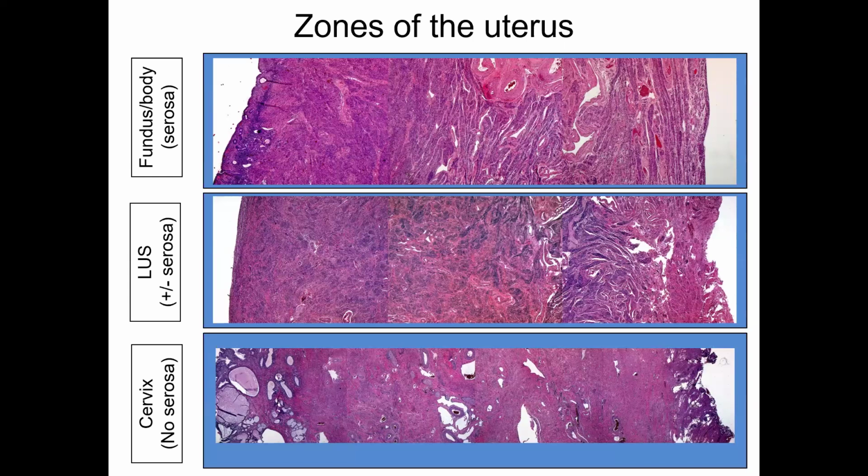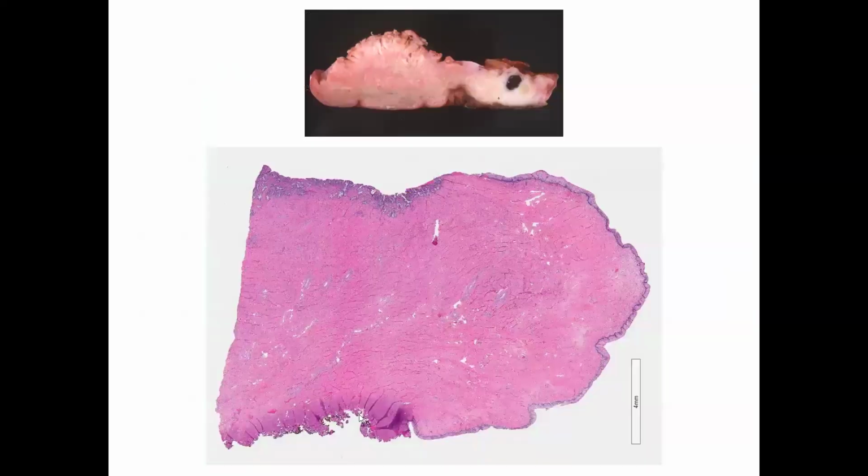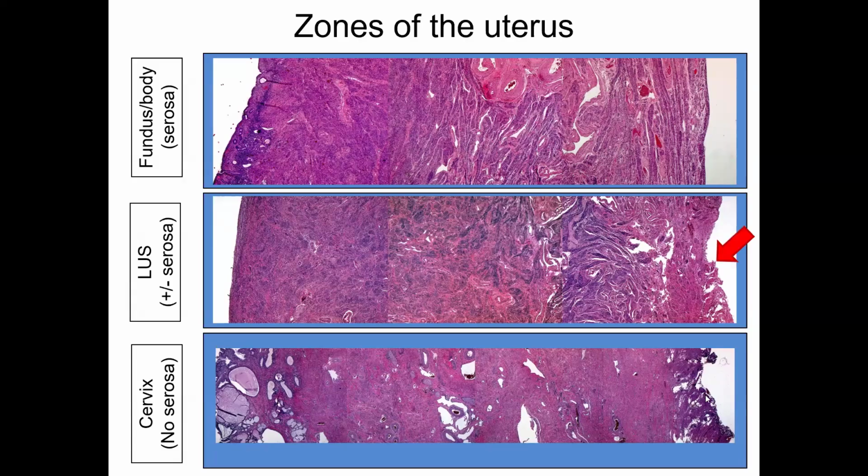This is a nice composite. I hope you think it's nice. So this is your cervical section. Here is the endocervical mucosa, and these are the endocervical glands. And here's the stroma of the cervix. Out here, what do we have? We have a cauterized tissue. That is this part. That is the surgical margin.